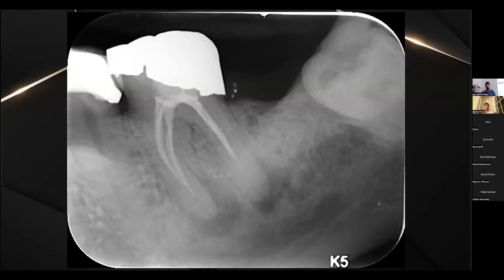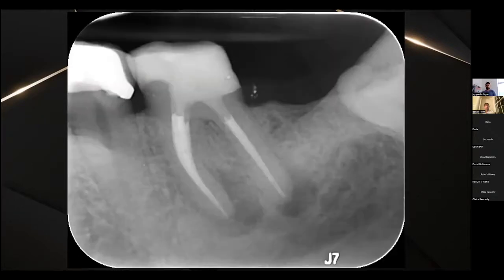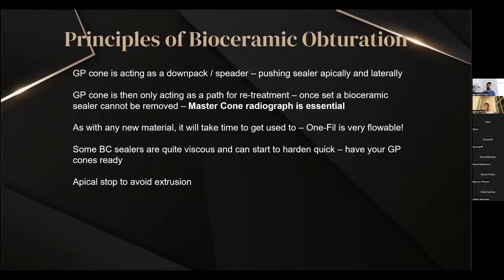And so the video that I just took was from this case. Again, we've got good working length control. And again, this was, frustratingly, another one which didn't come to its follow-up, so I don't have a follow-up just yet. But in cases like this, yeah, it does make a difference not extruding any bacteria in those areas.